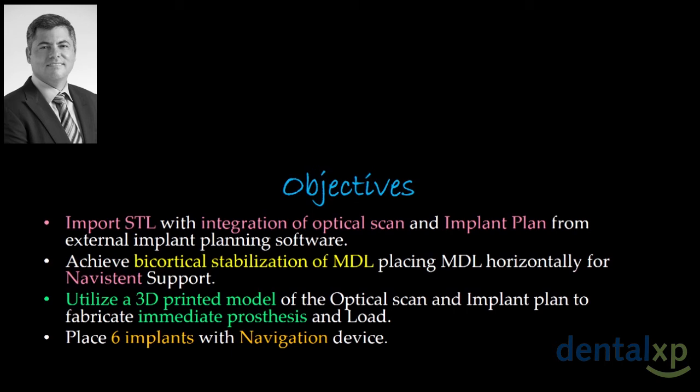Or you can even do it digitally. But you needed somehow to communicate. But then the next problem was, once I have done that, how do I place the implant in this type of software in the same position that I need so the two works fit? And that's what this case is about.